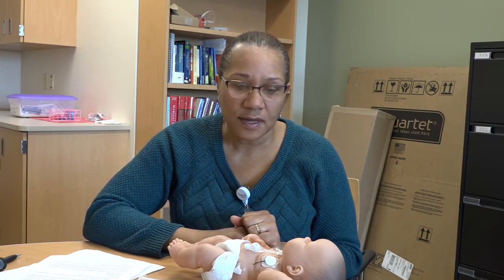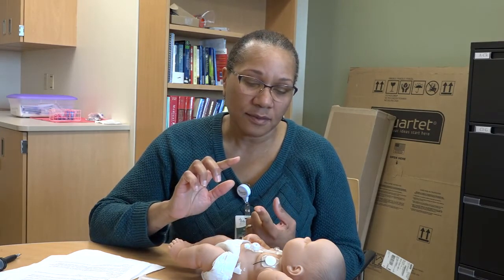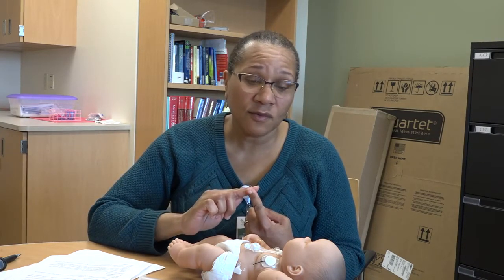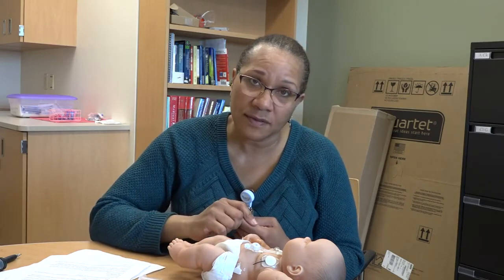There are two ways that we deal with granulation tissue. You're going to want to make a phone call to the office and let us know that you're thinking your baby maybe has some granulation tissue. And when they come into the office, we will use a chemical stick called silver nitrate, and we will cauterize or destroy that growing tissue around the site.